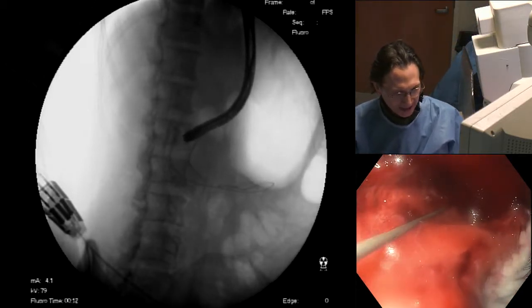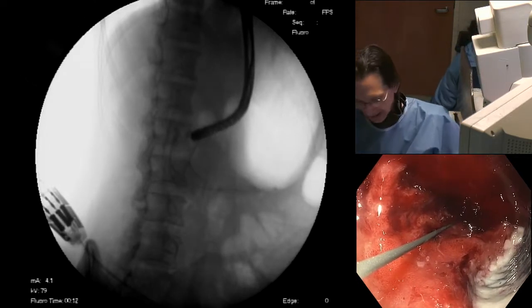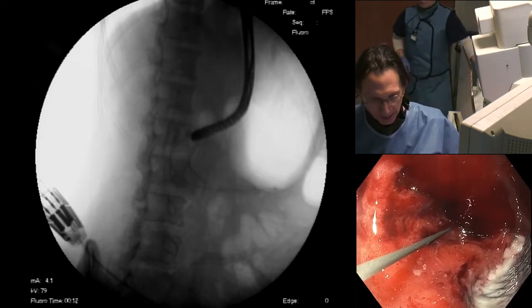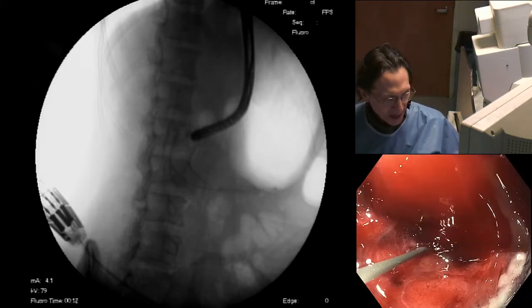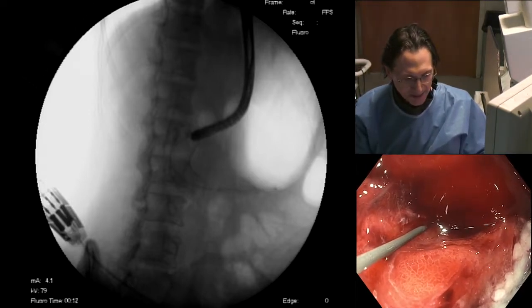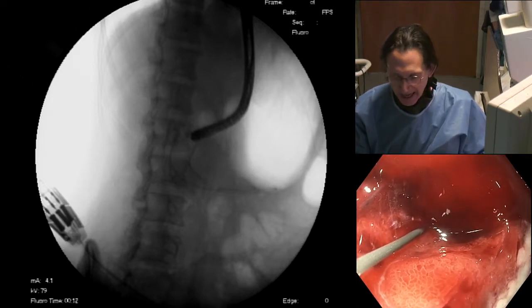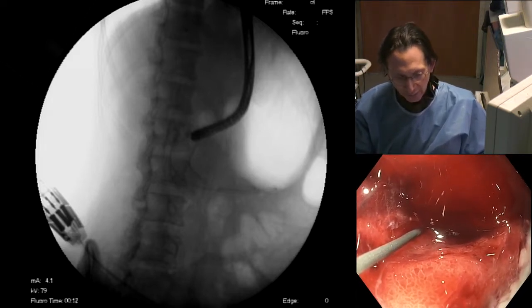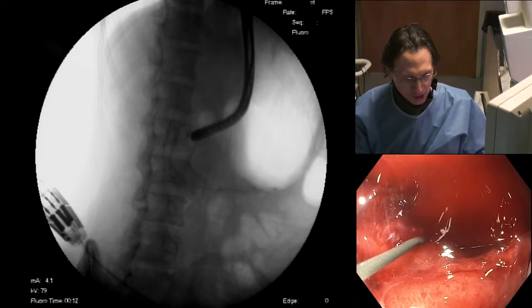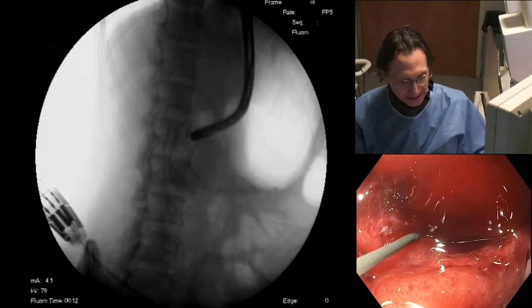It certainly looks like that. So let's follow this now with a catheter. We're going to feed a catheter over the wire, and then we're going to inject a little bit of contrast. What's nice about doing this is that we'll be able to fill the downstream small bowel, the distal duodenum, with water, and it's going to make it a lot easier for us to visualize our target for our gastrojejunostomy.